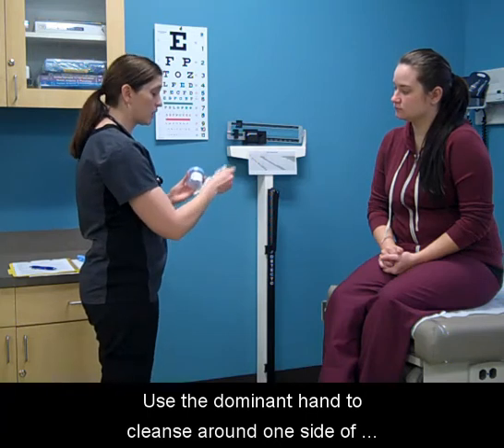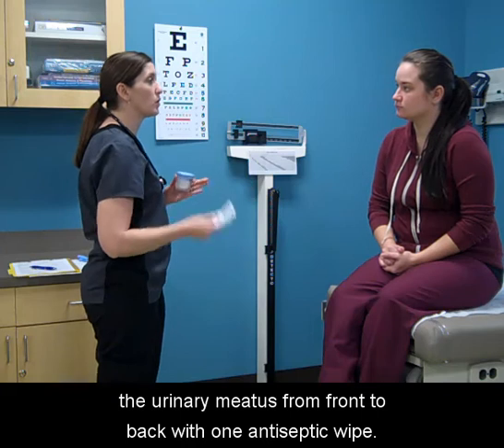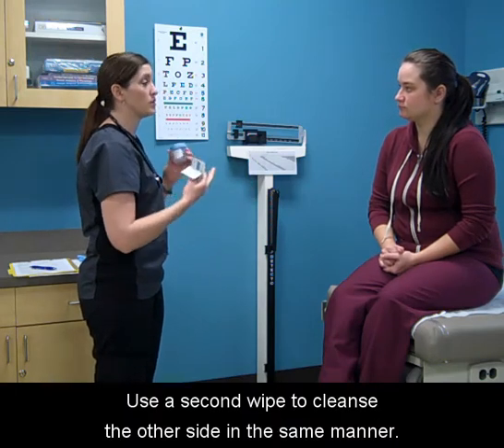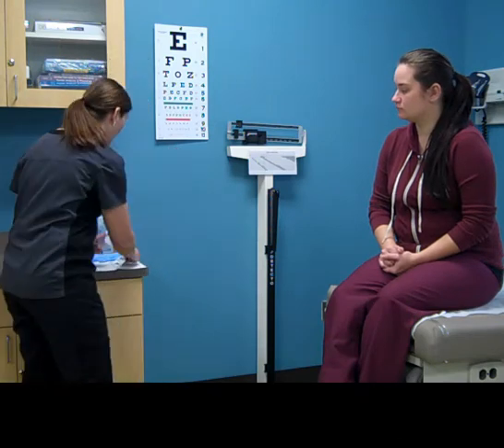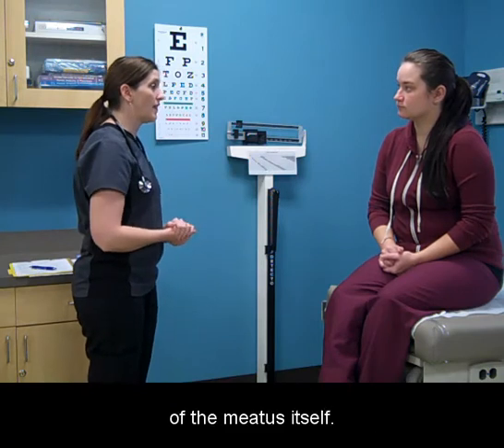Use the dominant hand to cleanse around one side of the urinary meatus from front to back with one antiseptic wipe. Use a second wipe to cleanse the other side in the same manner. Using a third wipe, cleanse across the opening of the meatus itself.